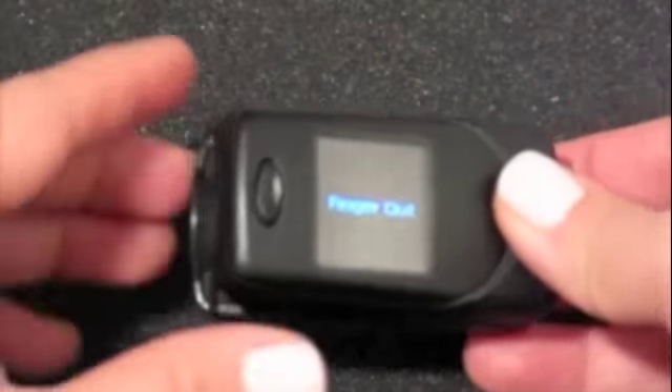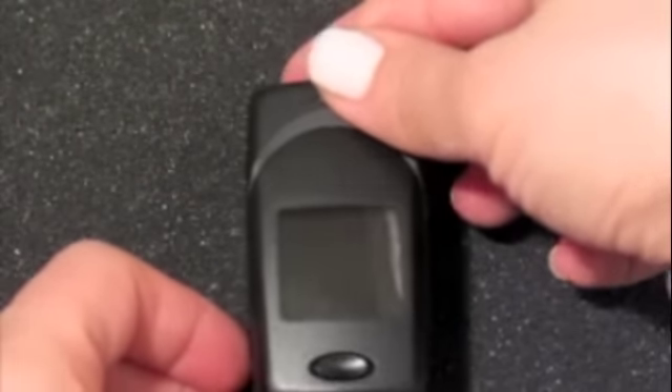Accurate readings are provided from the latest infrared technology. The oximeter has an automatic shutoff function once the finger is removed.